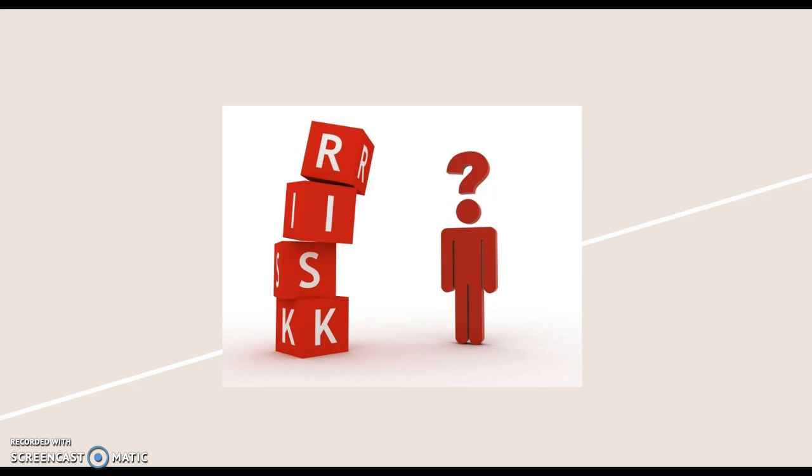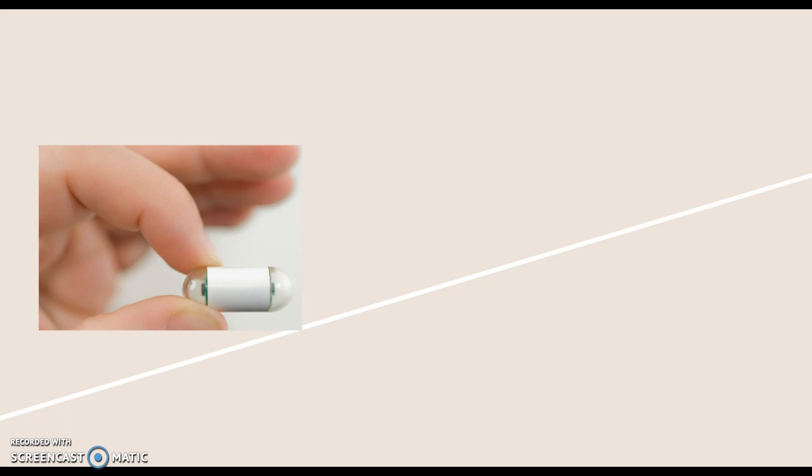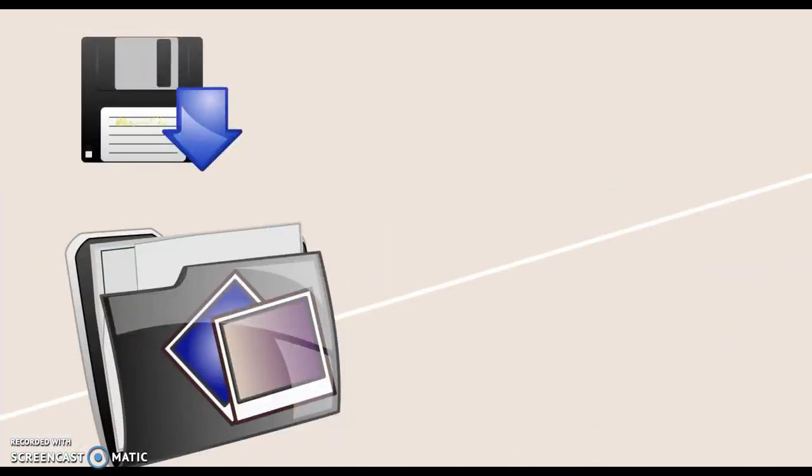According to Darrow, from the Harvard Law Bill of Health blog, less than 1% of procedures conducted have complications. However, there is a possibility of the capsule getting stuck at a narrowed spot in the digestive tract due to inflammation, prior surgery, or tumor. Depending on the area where the capsule is stuck, it might need to be removed through surgery or through a traditional endoscopy procedure. Risks increase for those who may have a specific condition that causes the intestinal tract to be restricted. A doctor will most likely consult and give you a CT scan if the patient encounters abdominal pain or is at the risk of narrowing of the intestine. Although there are no complications in most cases, it is important to note the possible issues.